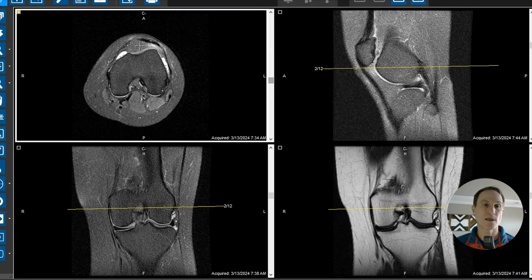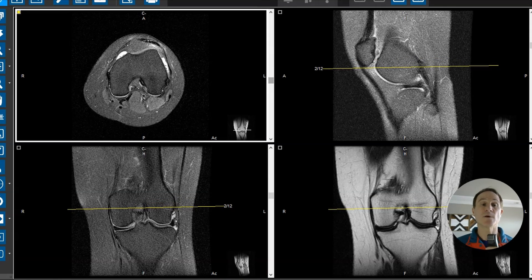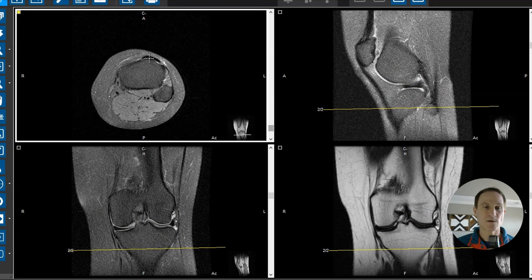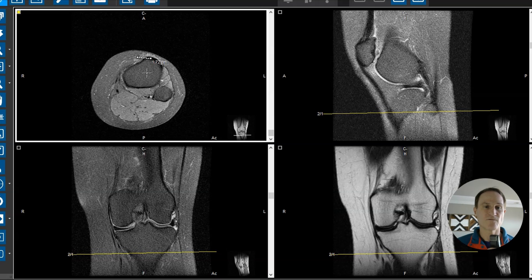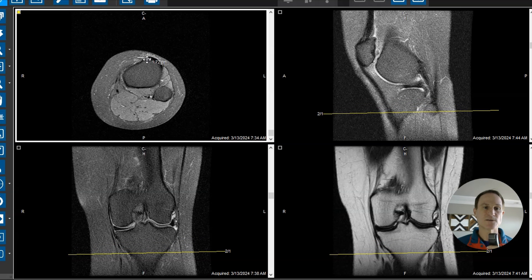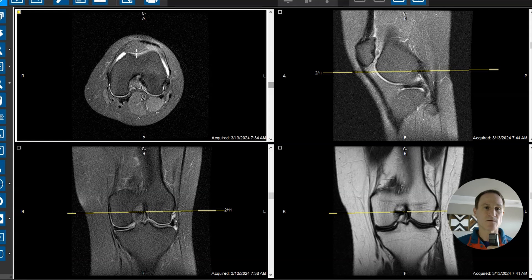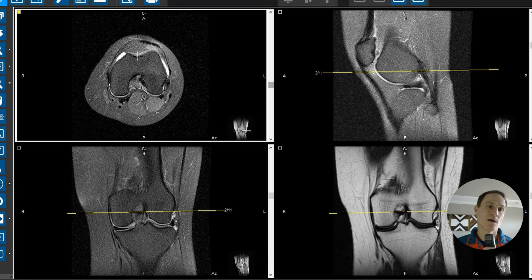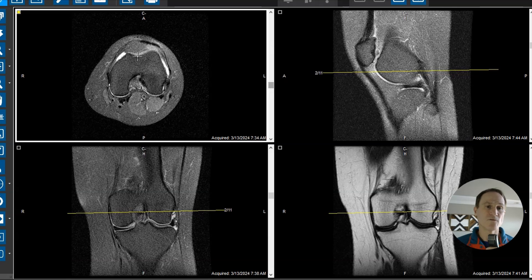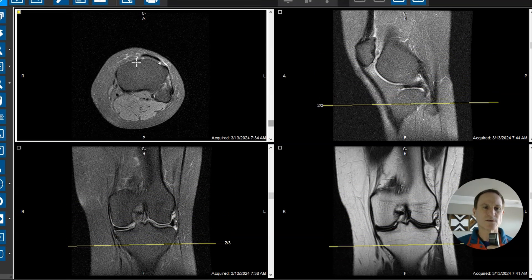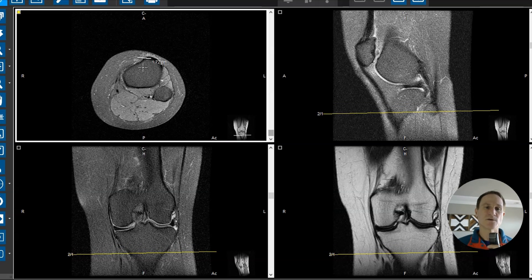Now one last thing we're going to look for is the patellar tendon where it attaches to the tibia. Here's the patellar tendon going down to where it hits the tibia. On this view, we see I drew a line from the tibial tubercle — right where the patellar tendon attaches — to the middle of the femur. So this is called the TT-TG distance, the tibial tubercle to trochlear groove distance, and that should be 1.7 centimeters or less. This one's right at 1.7 centimeters, so it's just a borderline increased distance, but this can be associated with a patellar tracking disorder.